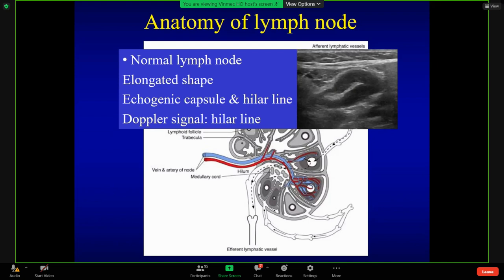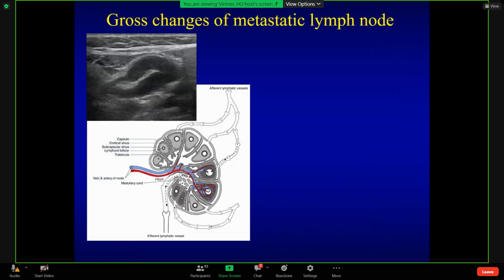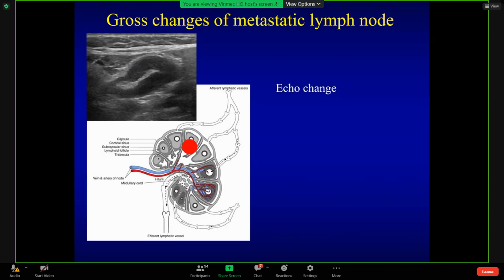A normal lymph node shows an elongated shape like this, with an echogenic capsule, as I introduced — it has a capsule like this — and the echogenic hilum. The cortex is usually hypoechoic, like this area. Thyroid metastasis is usually very small, so we cannot detect the small metastatic lymph node. Therefore, we should understand the change of echogenicity.